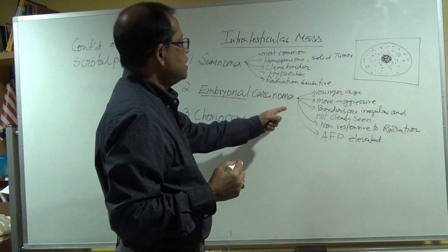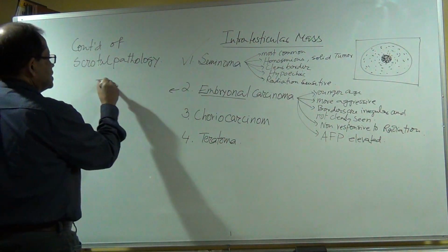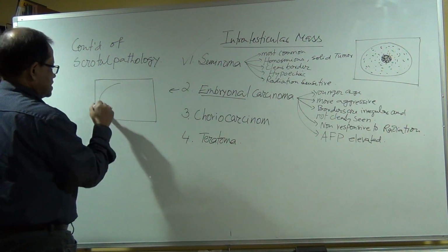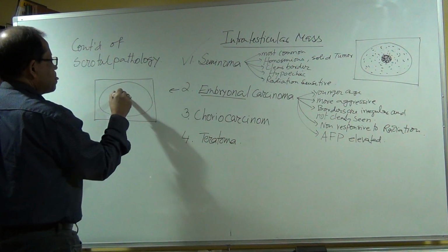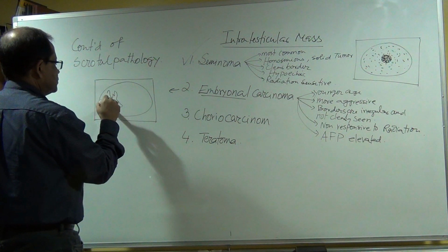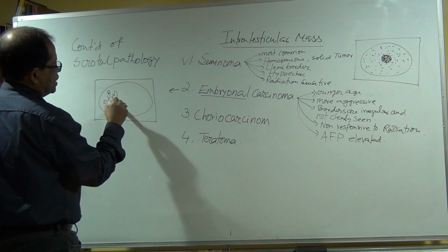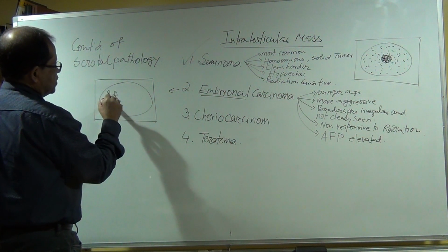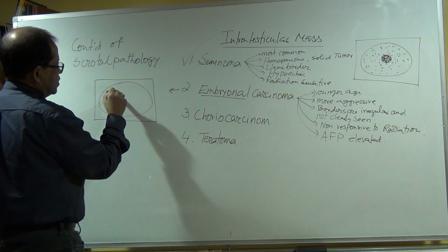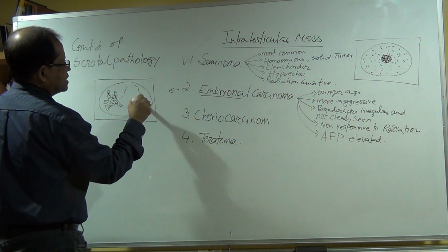And embryonal cell, embryonal carcinoma, so you will see this is testis, see how irregular the border is. And it tried to grab all the testes.